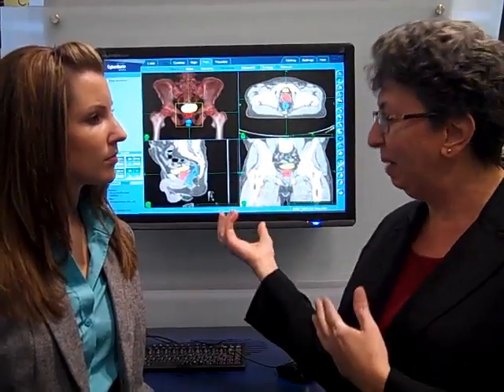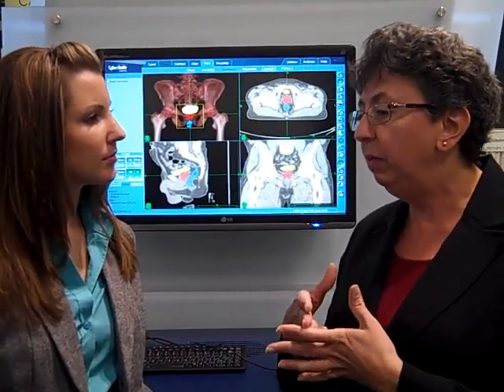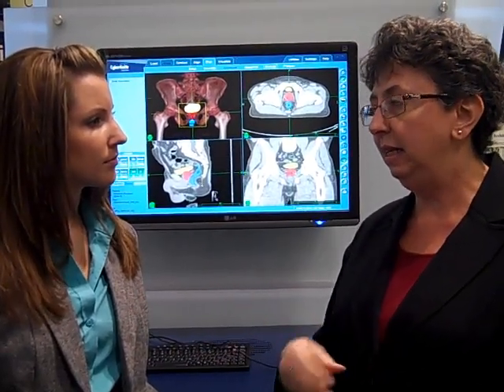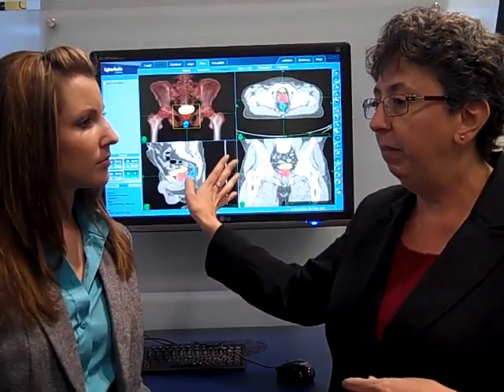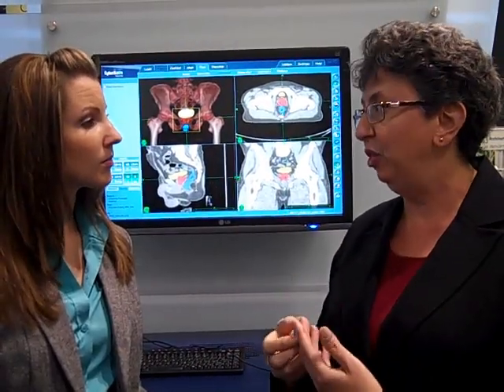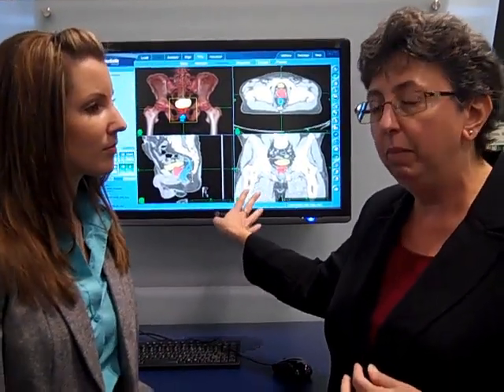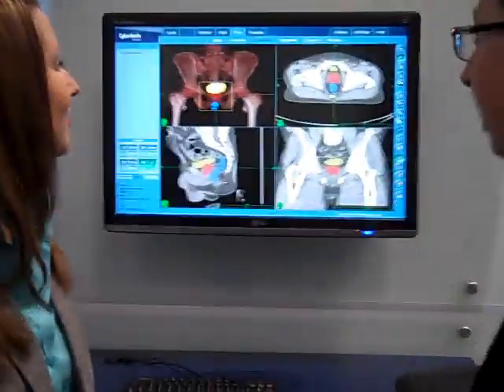The third main ingredient that goes into a treatment plan is the patient. Because we can't actually put our patient into our software, we take pictures of the patient in the form of a CT scan. Almost every patient who gets CyberKnife treatment will go for a planning CT scan prior to treatment planning. That CT scan is then imported into our software system so we can look at a virtual patient, while the real patient can go home while the treatment planning process is occurring.